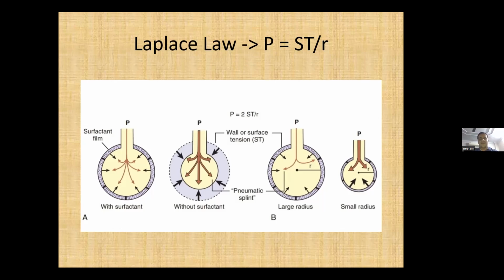That is why this concept is important for residents to understand, because that is why I always keep scolding. I want PEEP delivery to be more urgent rather than giving a surfactant on an urgent basis, right? Because both are important. If you don't give PEEP to the lungs, the alveoli will start to collapse. PEEP is actually a continuous distending pressure. So when I give that PEEP, by giving that pressure, I am preventing the alveoli from collapsing.